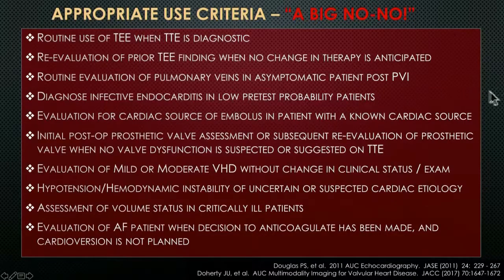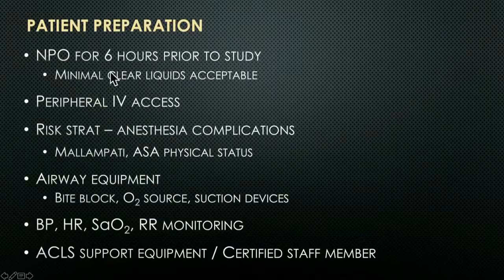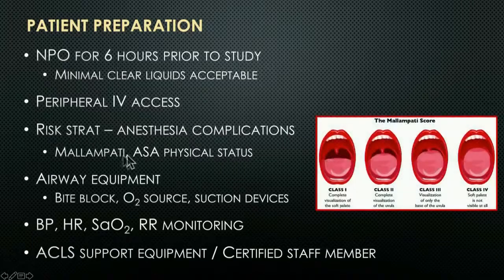So I've listed the highlights there, and that's really for memorization. Be aware of the preparation issues, NPO for about 6 hours prior to the study. Make sure you have peripheral IV access. Obviously, you need it if you're giving conscious sedation. Always risk stratify, particularly important using the Mallampati grades in class.